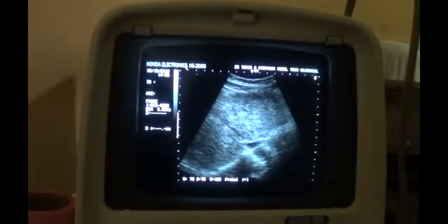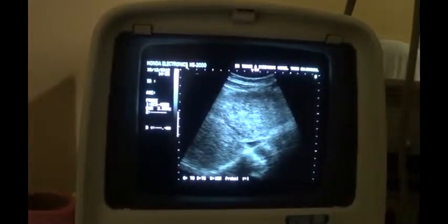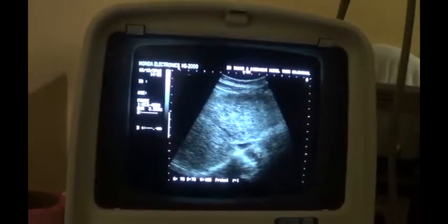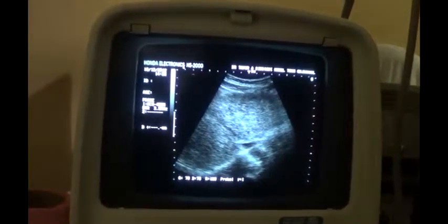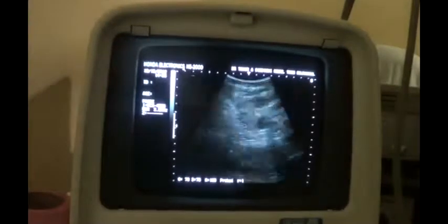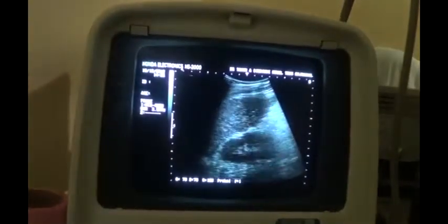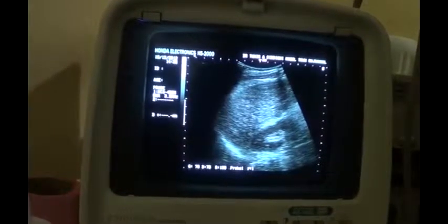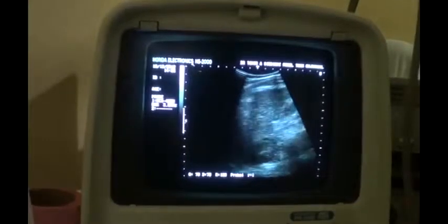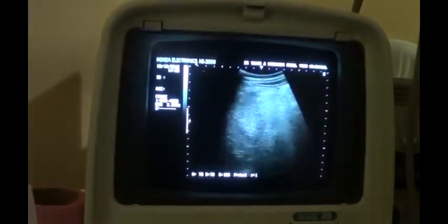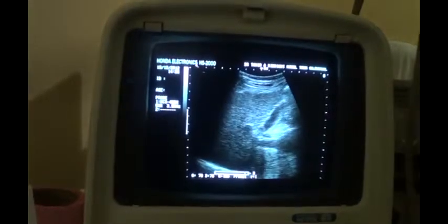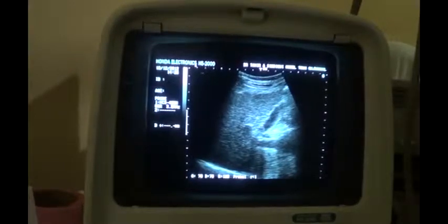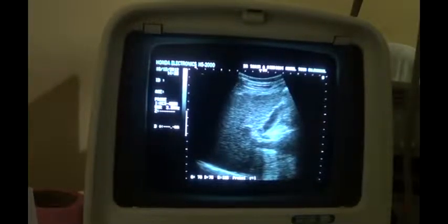Coarseness throughout, blurred vessel margins that are a bit tortuous as well. This is the middle hepatic vein and the irregularity of the outer surface. So this is an advanced stage cirrhotic liver. Note the degree of coarseness throughout the liver parenchyma.